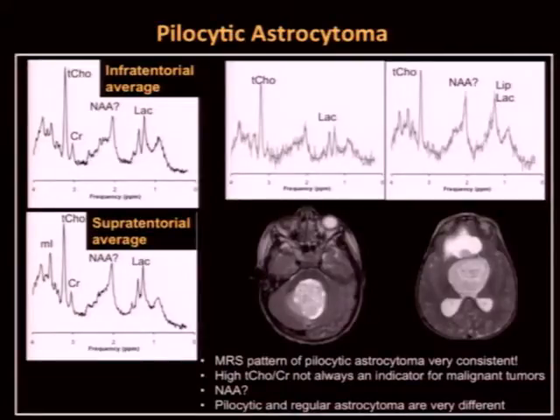In terms of spectroscopy, if you use short echo spectroscopy, you can actually diagnose pilocytics, and I'll tell you why. Usually they have very noisy spectra at baseline because they're hypocellular tumors. And if you use LC model or some sort of a program to help you quantitate the metabolites, they're usually very low in concentration across the board. And so it's an example of where using quantitative spectroscopy can actually help you with the diagnosis. But you have to be familiar with how to use LC model.